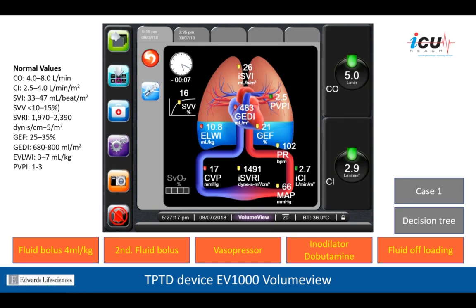So in other words, I don't think this patient would benefit much from inotropic support. You can see that we have an option of dobutamine. We'll see what happens if we do this intervention. The third thing that I would do is assess his afterload, or systemic vascular resistance.